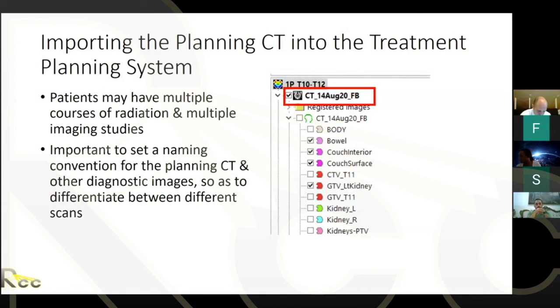Okay. The second question was from Abdu, and his question was, do you have to use the same, I think his question meant gating window. He said gating, is it the same every day? And I told him, yes, whatever you set at time of planning, that's what you use throughout your treatment, correct? That's correct. At the time of planning, you don't even need to decide that at the simulation, because you just basically choose some phases, and you use those phases for planning, and you use those phases for gating the treatment at the same time.